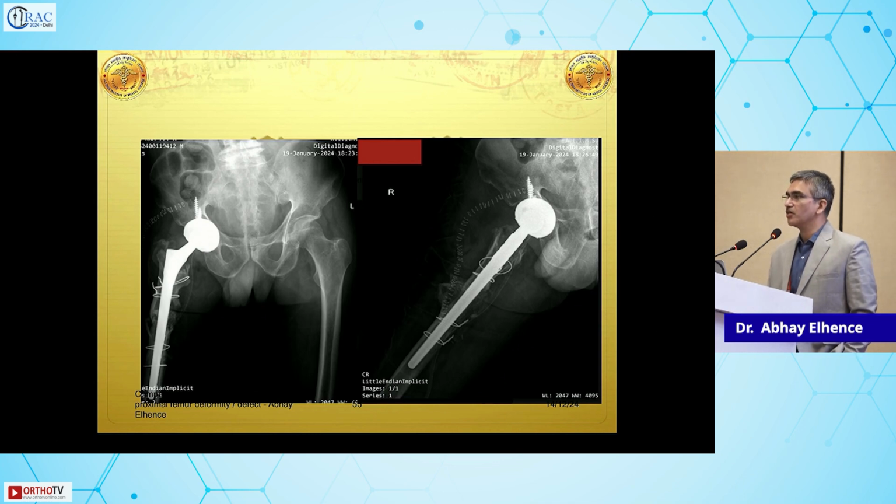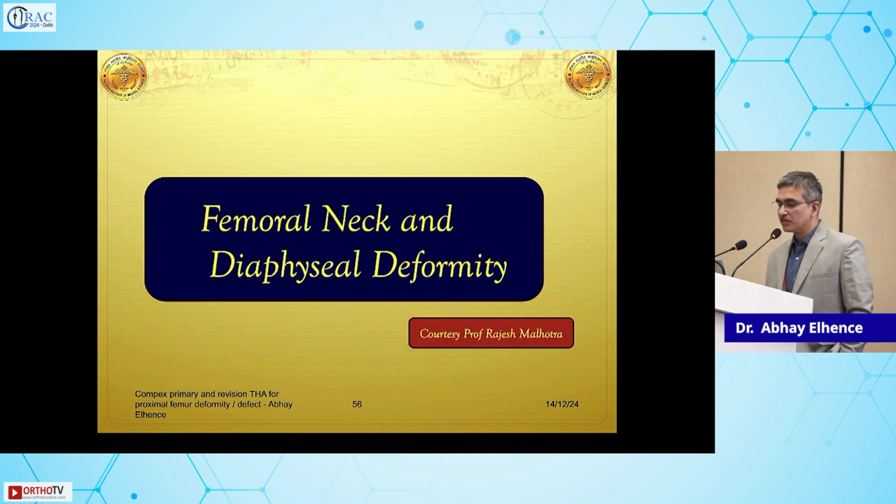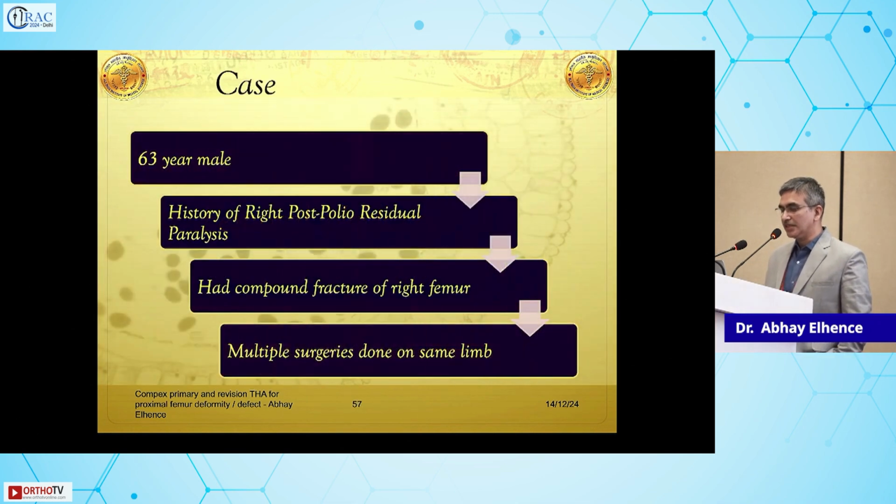You could use a modular or a non-modular variety depending upon what your practice is and what your patient is going to afford, but these patients did very well. And this is a case from Professor Malhotra sir, where he's dealt with a proximal femur deformity, where we've just bypassed the deformity and done a proximal reconstruction.